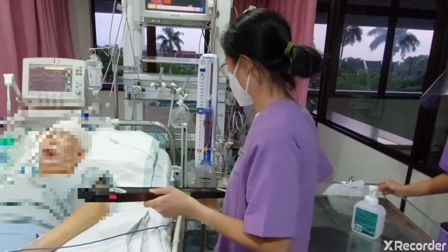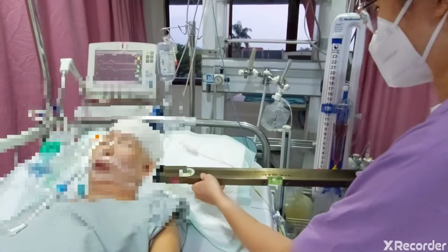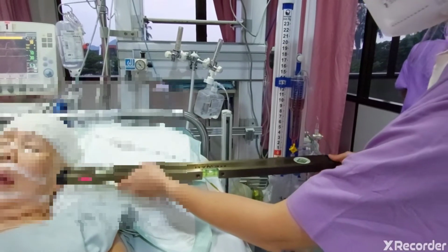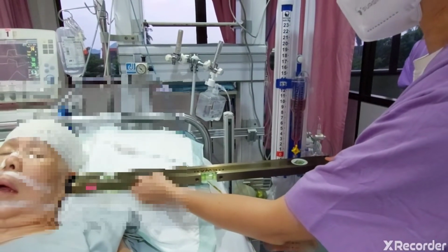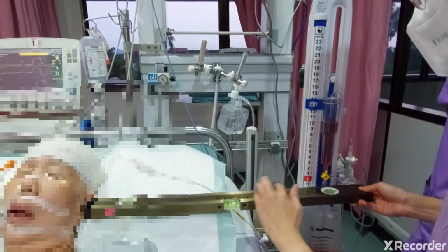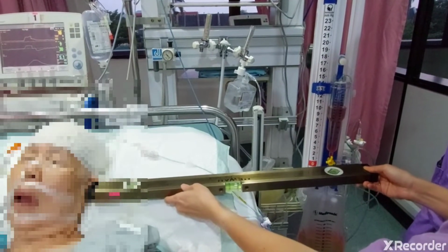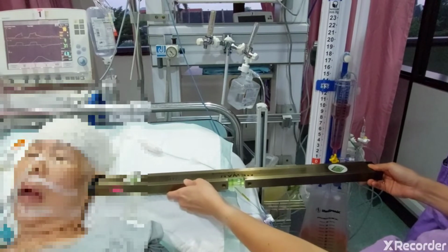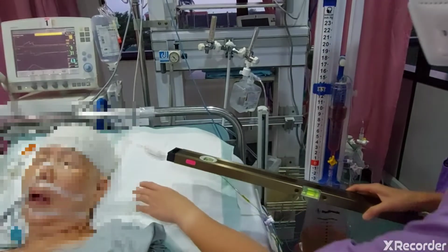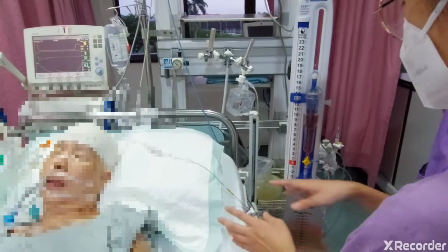First of all, to measure, this is the tragus of the ear. Let me show this EVD system. This stopcock is at the same level as the tragus, and ensure the bubble is in the middle. Lisa, do you know why we need to measure from the tragus of the patient's ear? Ventricular reference. Yeah, this is the ventricular reference point for the brain. So after that, make sure it is on the same line.